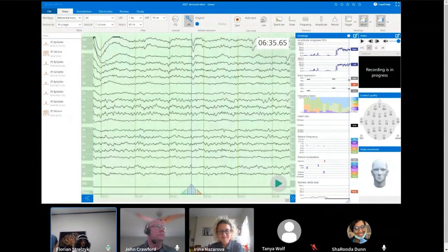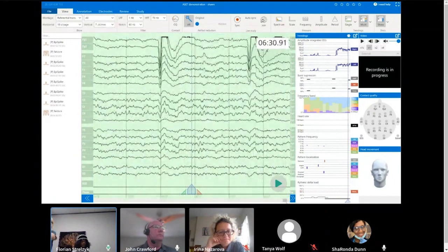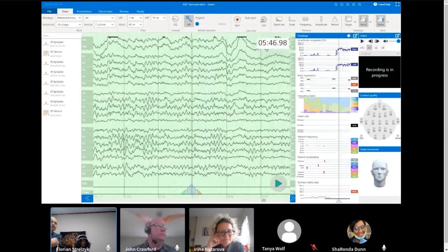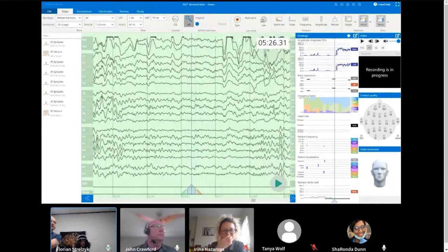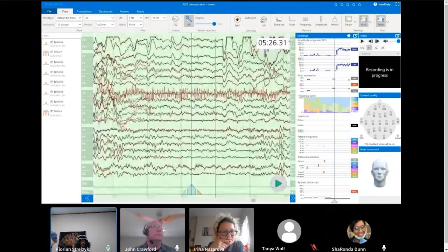So what I did, the recording is still ongoing, but I switched to something we call a review mode, where you can look through everything that's already been recorded. And just want to show you a little bit of the features here. We can do a spectral analysis real quick and kind of see where the alpha is, what that looks like. We can also engage something we call an artifact reduction. That's an algorithm that pulls out muscle artifacts and certain settling artifacts from the electrodes.